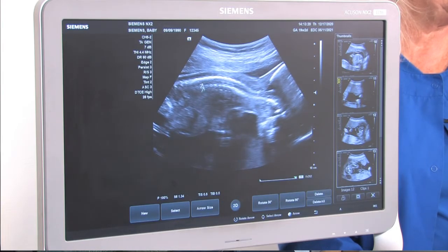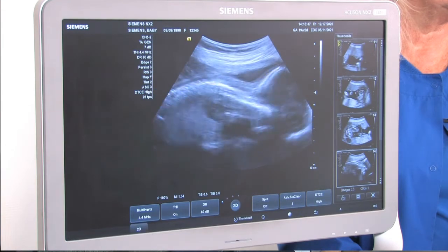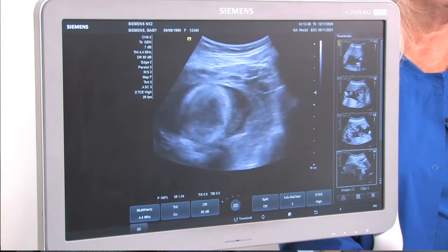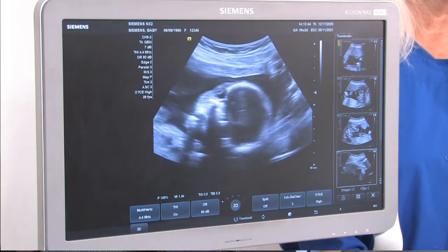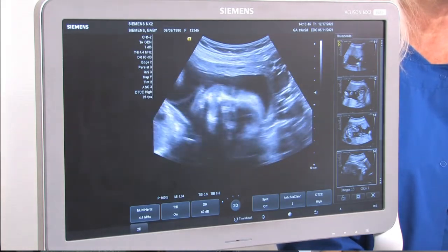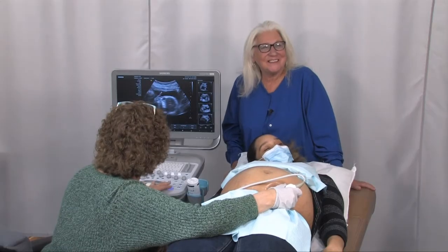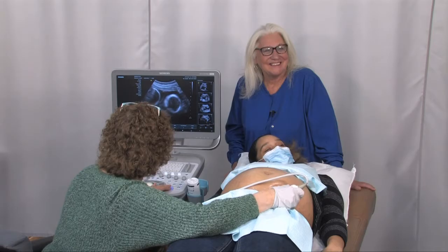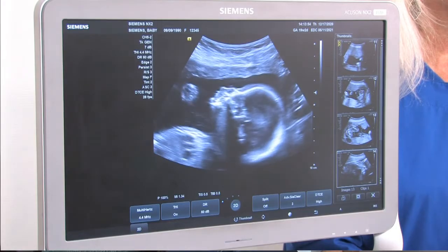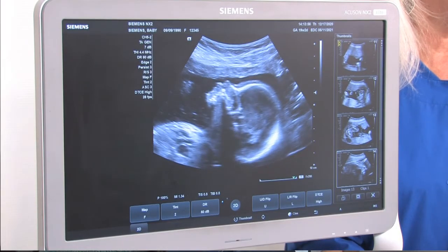She's being shy. The chin is down here and the face is kind of looking at the floor, and here's the spinal cord. And that one would be A. Unless I can come in from a really different angle. Oh, there we go. I'm going to push on your tummy a little bit and try to get a different angle. Oh, that was cute. Oh, so cute. And even, oh my gosh, there's a profile. Oh, that's beautiful.